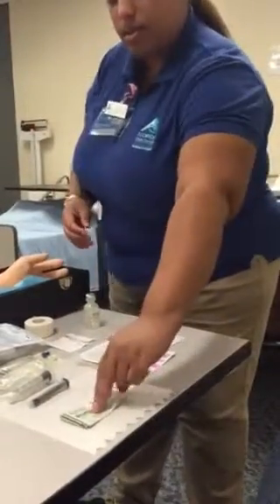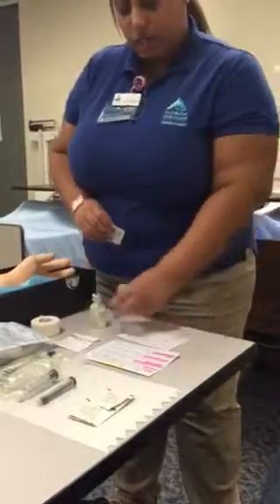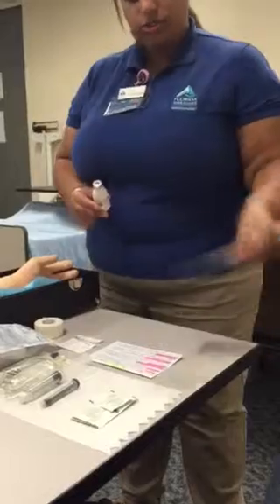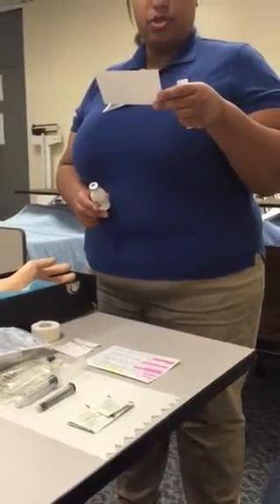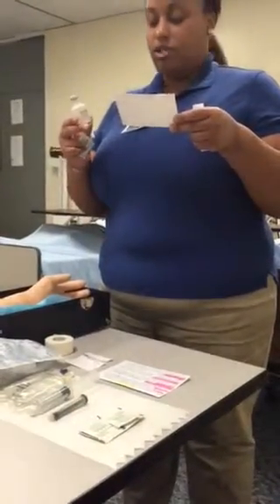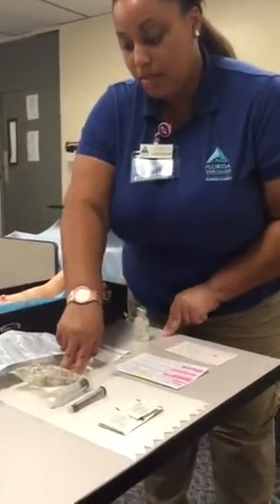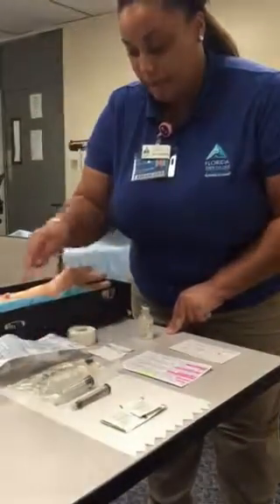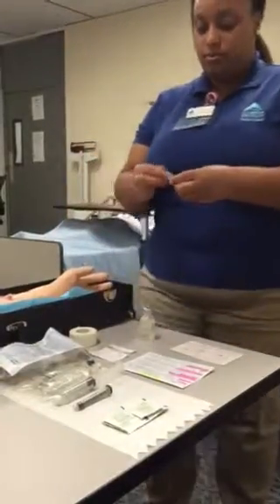Then I will proceed. For this medication, I have to use 1 gram equals 2 mLs. My prescribed dose that I'm going to be giving is 1 gram, so I'll be taking 2 mLs out of this bottle. I've checked and seen that it's not expired. My medication in my bag is not expired, and my bag here is intact and in good condition.